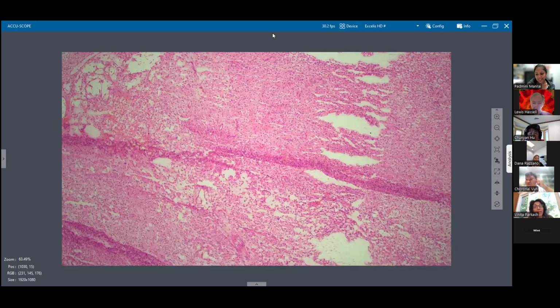In a young patient versus an older patient, this is a fairly straightforward diagnosis because corpus luteum is just not in your differential. It looks very solid, so that also makes me think of tumor. But depending on your cut of the corpus luteum, if you're cutting perpendicular and don't get the central portion, it can look very, very solid.